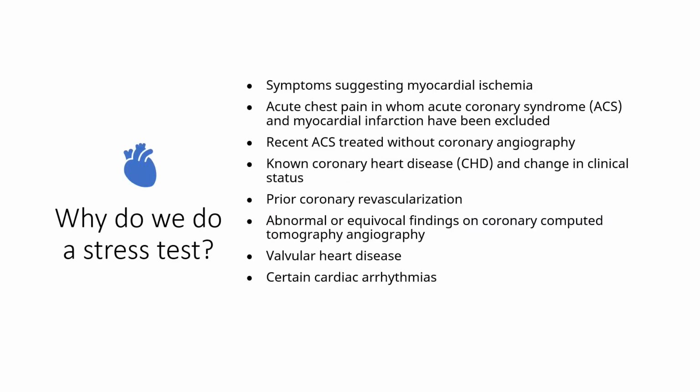So why do we do a stress test? The most common reason for doing a stress test in our lab is for detection of significant obstructive coronary artery disease, which means are there blockages in the arteries? The blockages have to be significant and cause flow limitations for the stress test to be abnormal. The stress test will not detect all coronary artery disease.